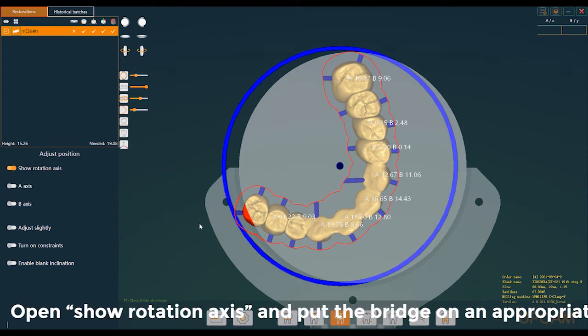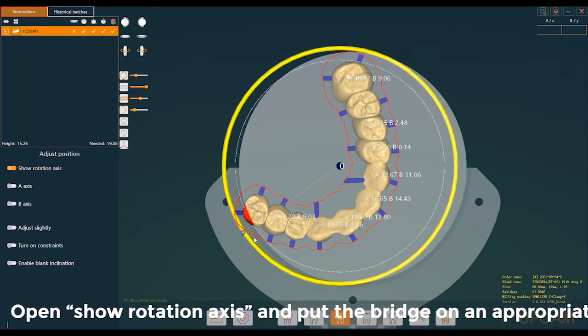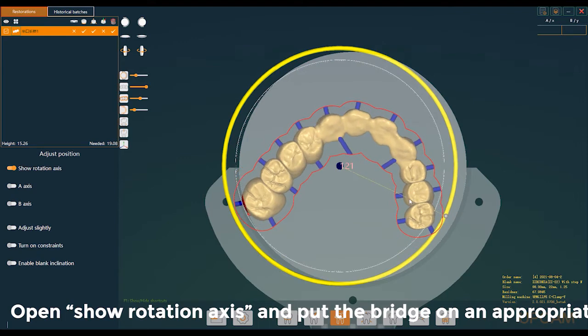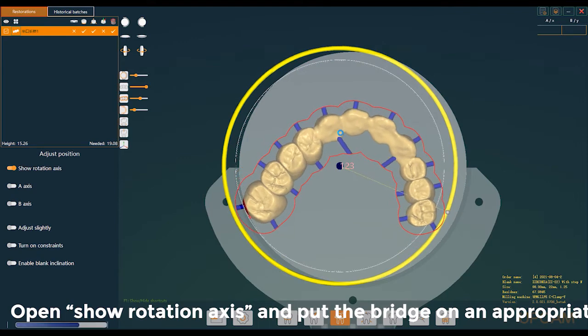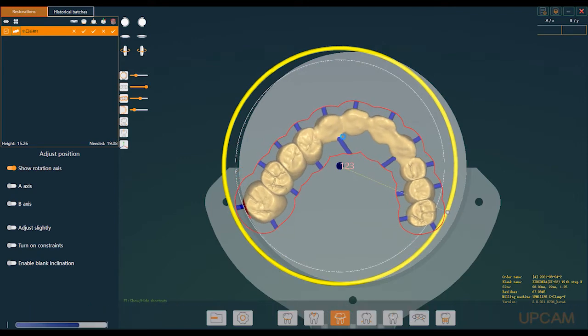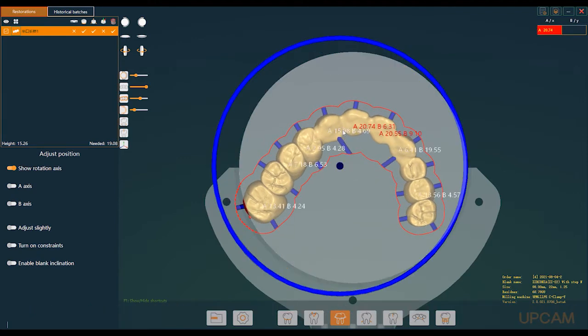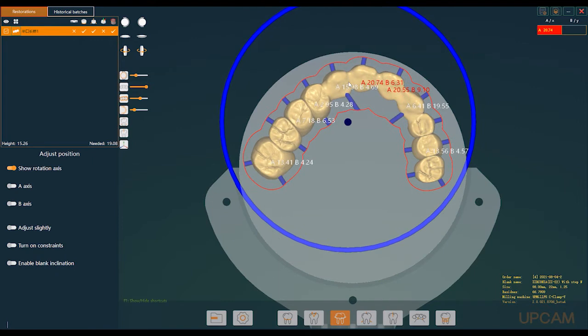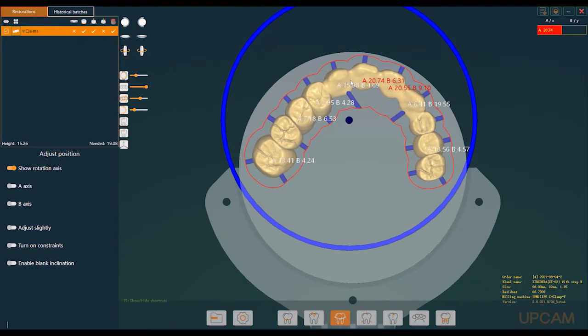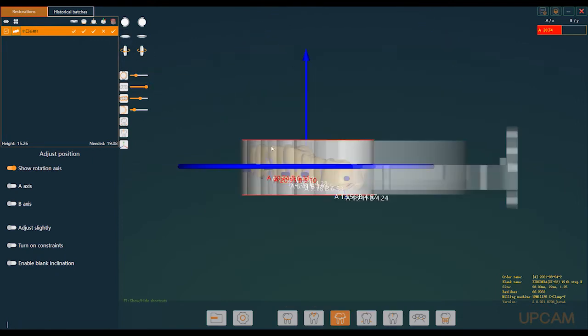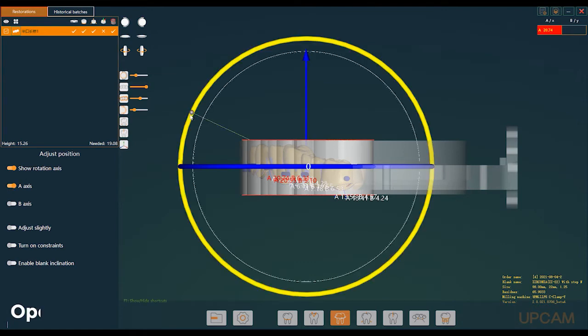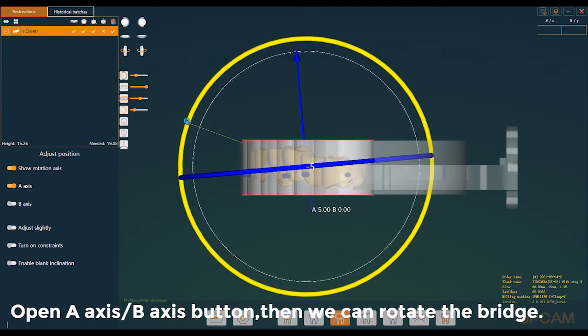Open show rotation axis and put the bridge on an appropriate edge position. Open A-axis B-axis button, then we can rotate the bridge.